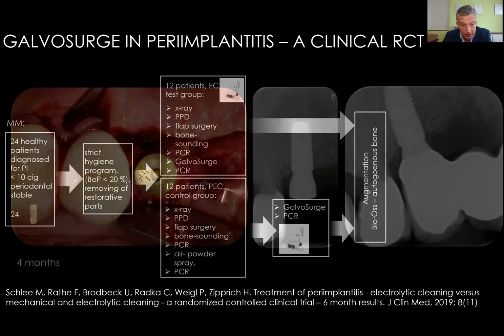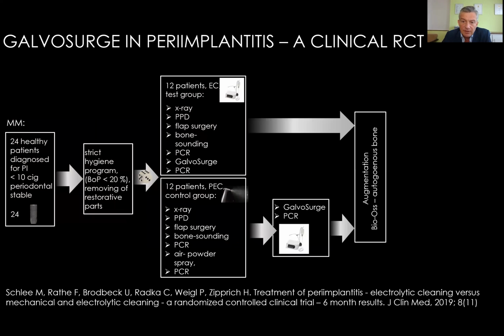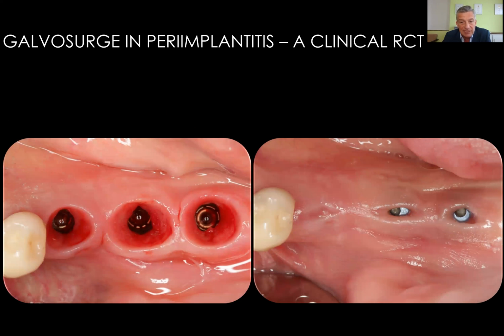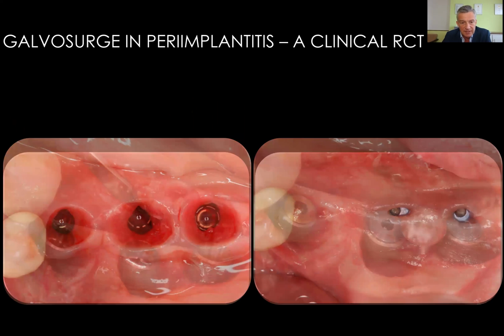And again, after 6 months, those patients were reassessed. We did the second stage surgery, X-rays, and a bone sounding again to have a clinical idea what happens over time. Let's come back to this case.